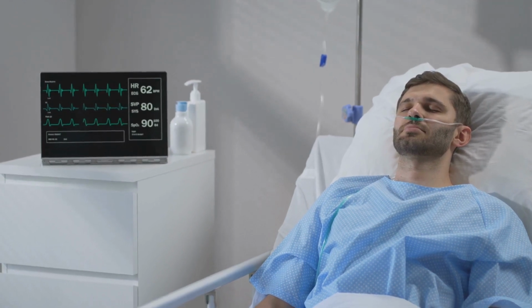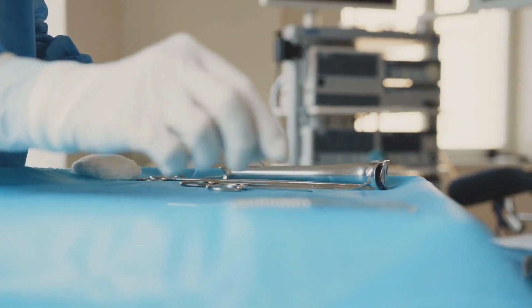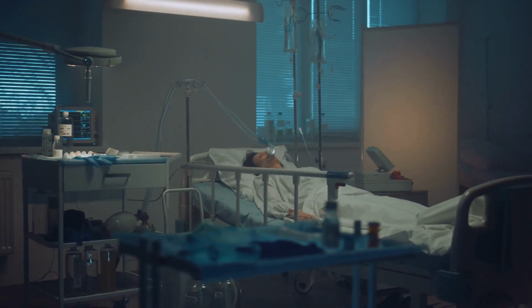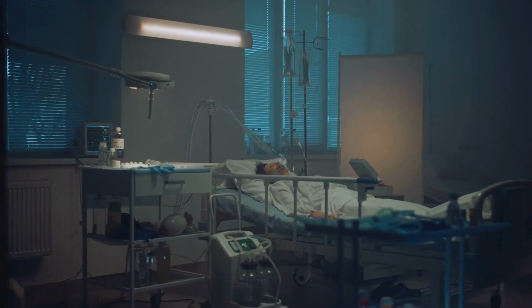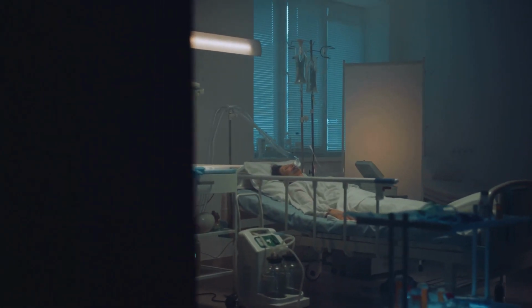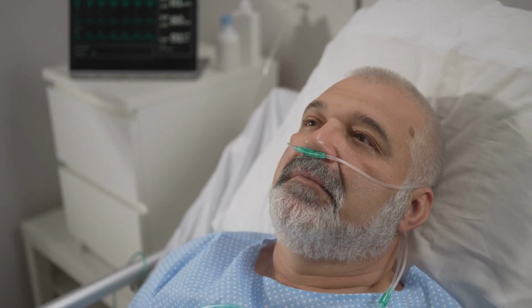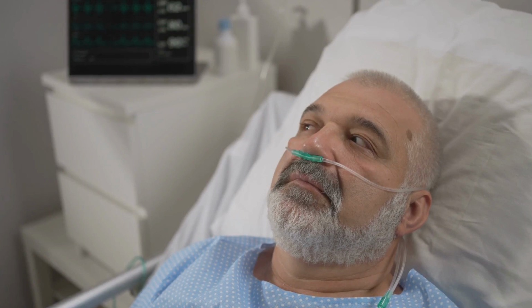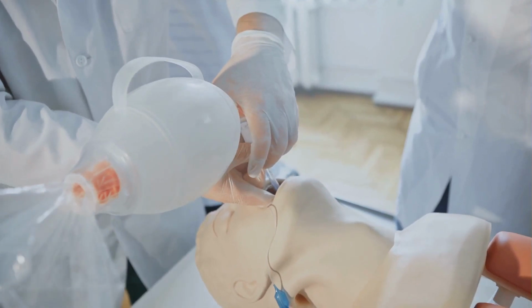Next, we'll tackle the contraindications to this procedure. While awake intubation is highly beneficial, there are situations where it may not be the best choice. You see, not all circumstances are ideal for this procedure. Certain patient conditions or scenarios may complicate or even prevent the execution of awake intubation. For instance, patients with significant airway obstruction or severe respiratory distress may not tolerate the procedure. Similarly, those with severe anxiety or uncooperative behavior may also present challenges.